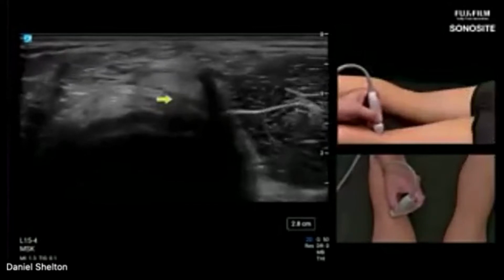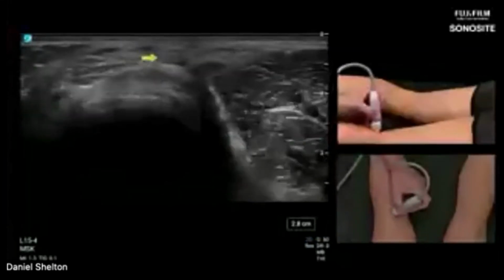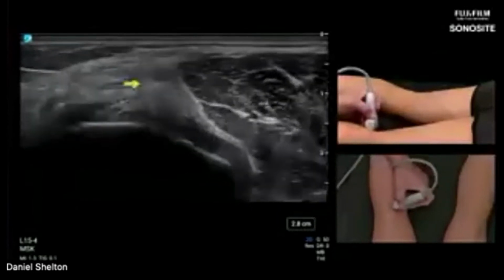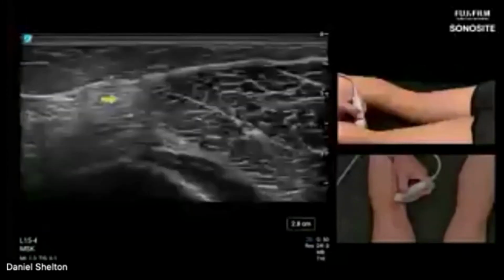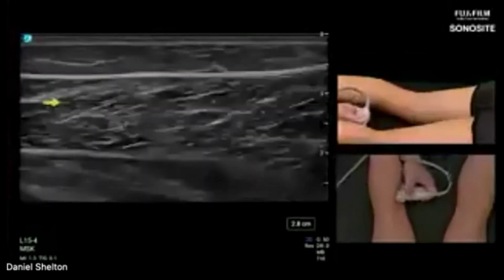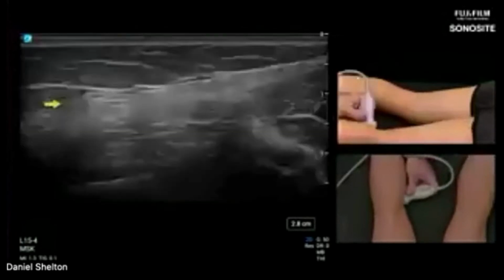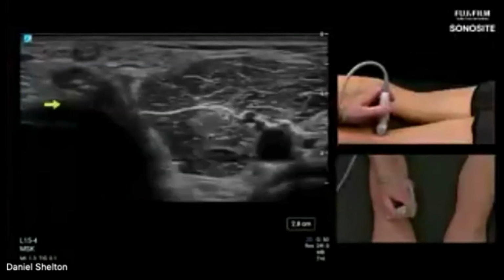And then the other dark structure up top here, not discussed too much in the PowerPoint, semitendinosus, also easy to track down as it wraps around to the pes. We could confirm that because we just scanned the pes anserine in the last webinar, and I'm just going to trace that distally, further medial. I could elongate it, and I'll probably end up with a very similar view that we got in that medial part of webinar number 2.